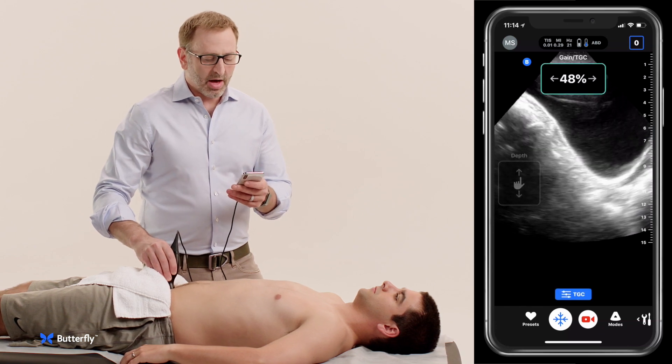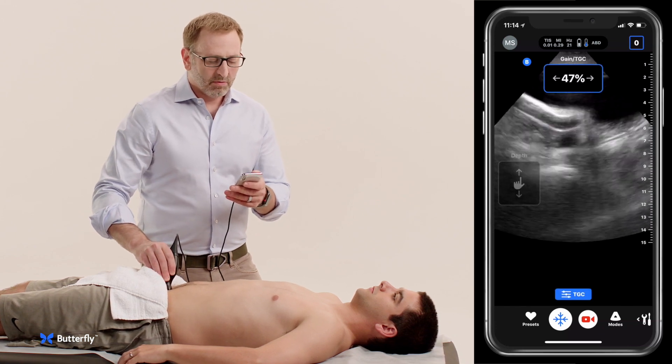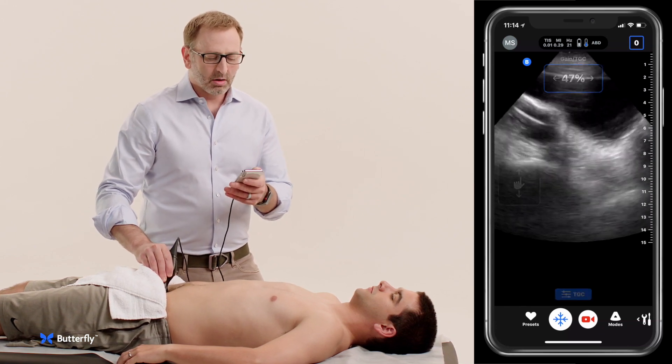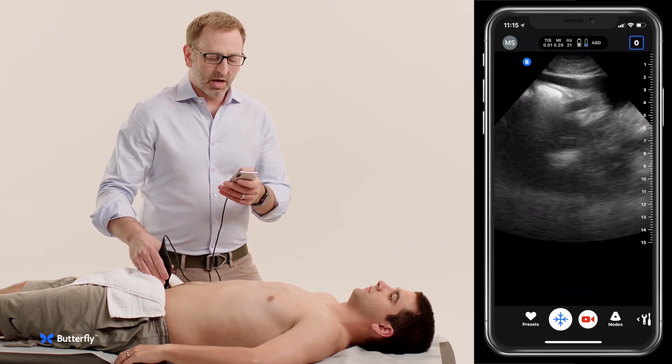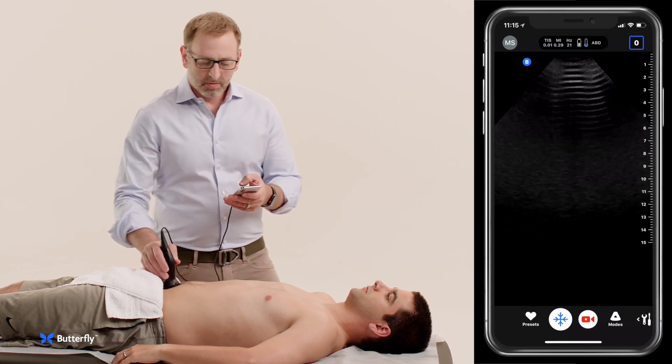Then we move on to the pelvis and take a look at the bladder, fanning left and right to look for any fluid in the pelvis behind the bladder or deep to the bladder.